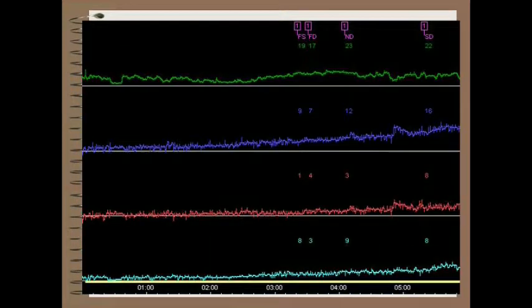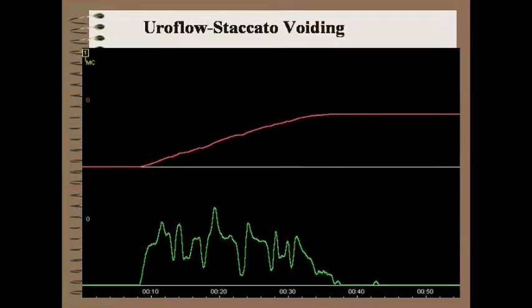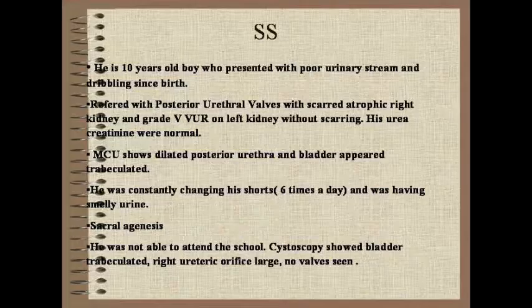The bladder was a low risk bladder, and I referred him for urotherapy. I just put it again because I got him to void 3-4 times, and every time he could reproduce. His bottom is not coming right down, I think. Am I justified in calling it? Okay, I've passed the exam now, because I see Dr. Sripati nodding his head.